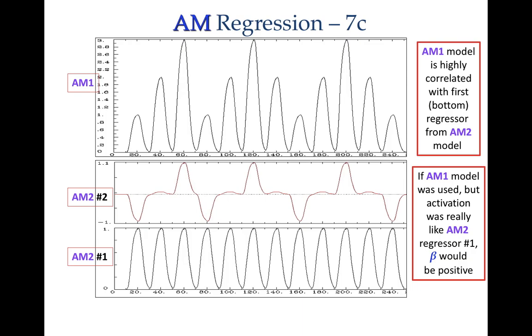It's just some low-level function area or something like that. So what do we get if we did it with these two regressors? We get a big beta for this and a tiny beta for this, which would all come from the noise fluctuations. So we'd say, well, that's a tiny beta with a tiny t statistic. Fine, this one is active, but it's not differentially active.